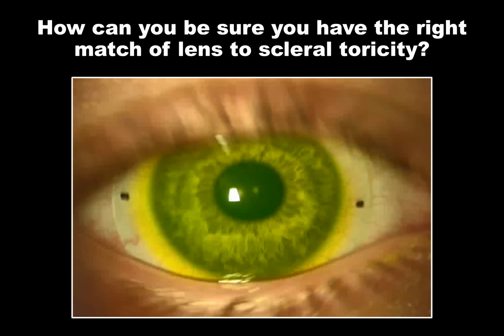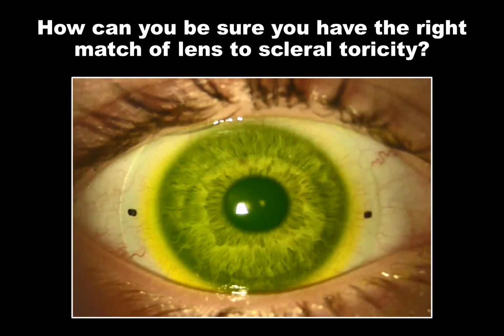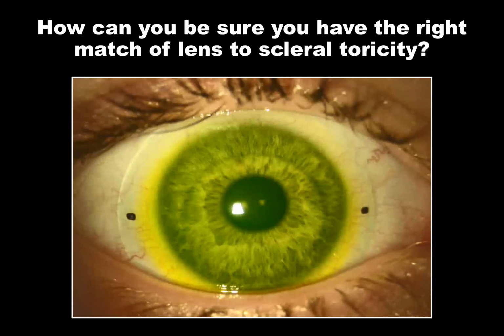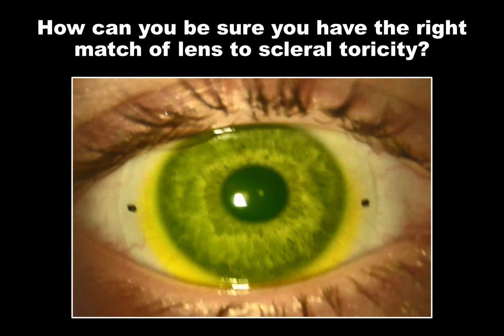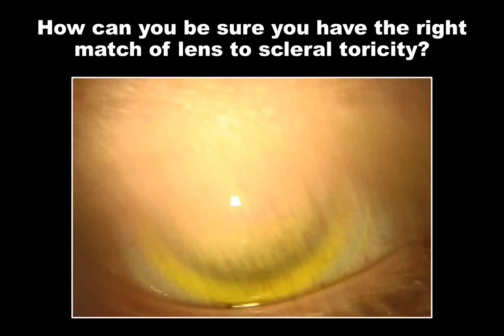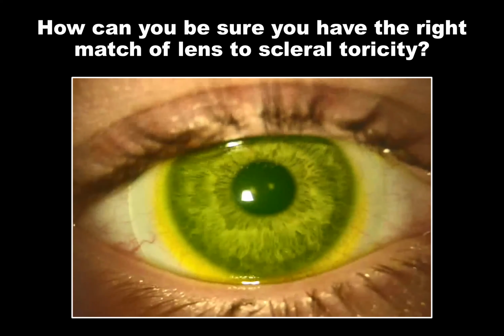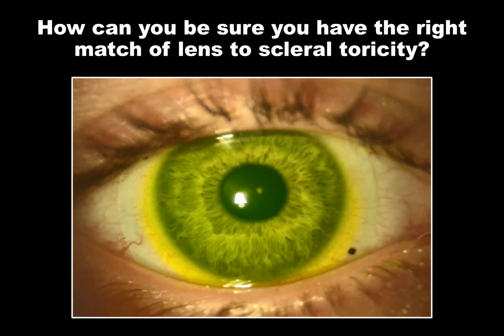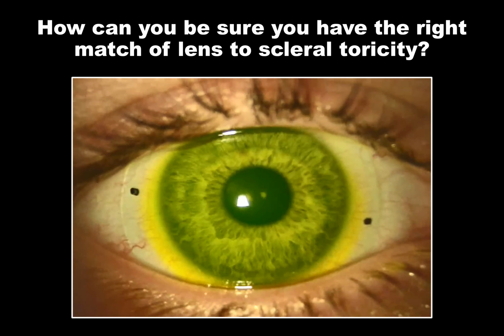The major difference in comfort that I've found with a symmetric versus a toric is if I were to fit a patient with a scleral lens and they are a brand new patient to contact lenses or a brand new patient to scleral, they will usually say that the comfort is an 8 out of 10 on a scale. So in other words, a symmetric scleral lens is usually 8, maybe 8.5. Now, if we put one eye in a symmetric landing and one eye in a toric landing scleral lens, like the SmartLens, then usually the patient will choose the toric as immediately being more comfortable.